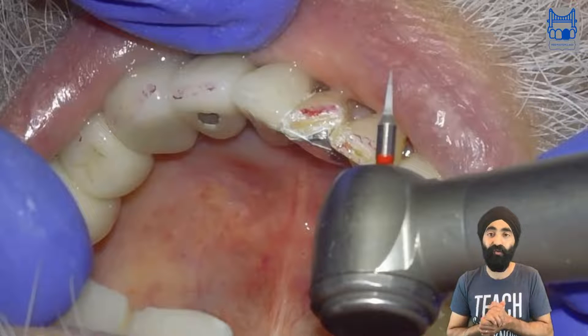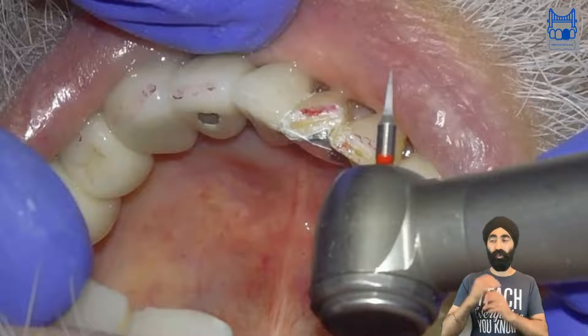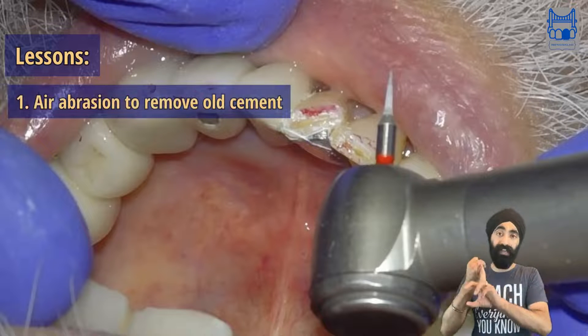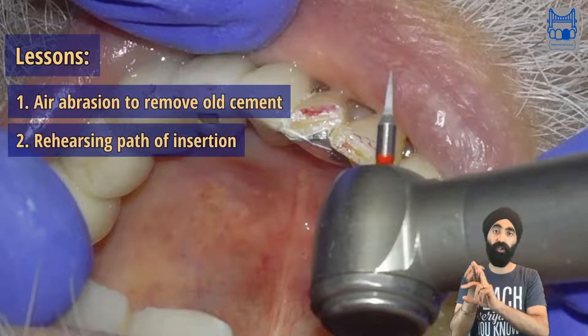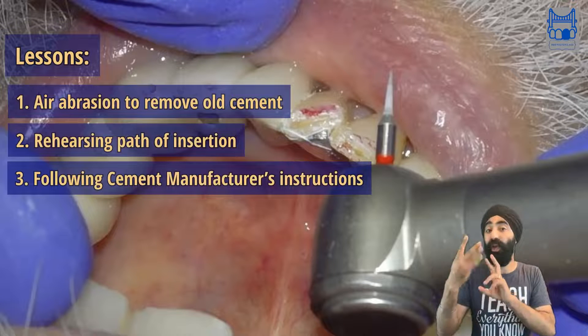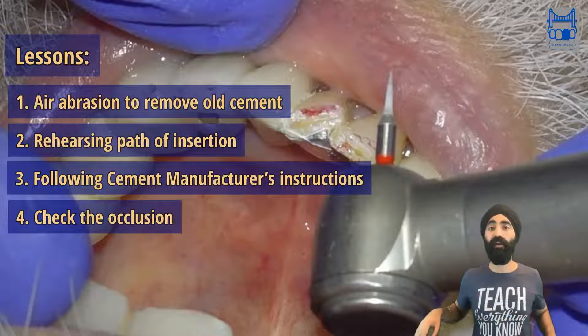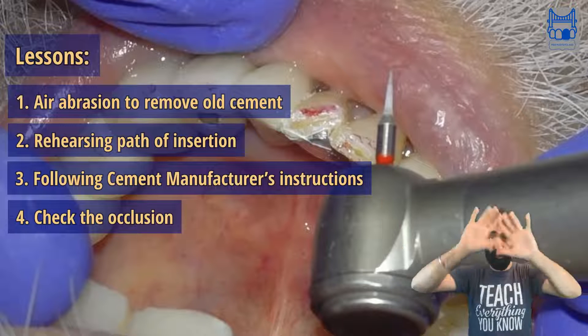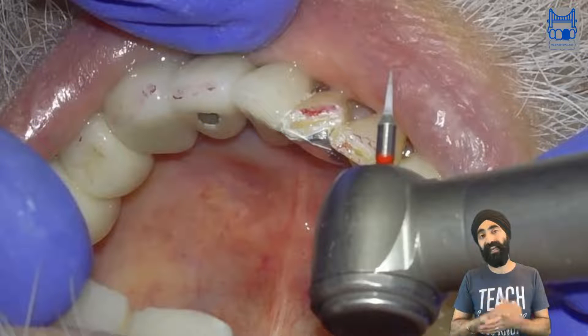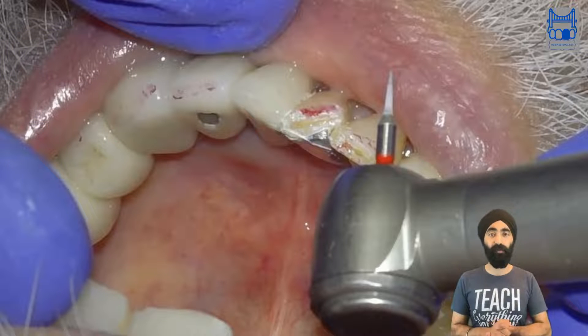And that's how I did the resin bonded bridge re-cementation. The lessons: air abrasion to remove the old cement, rehearsing your path of insertion, following the manufacturer's instructions for whichever cement you use, and checking the occlusion at the end to make sure you don't have any excursions — no more red. We are allowed to have some blue, basically. And that's how I re-cemented this resin bonded bridge.